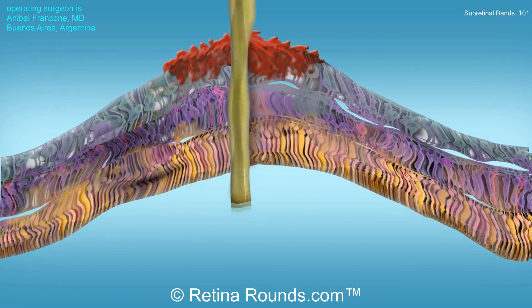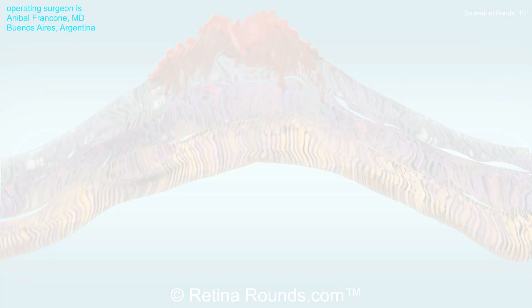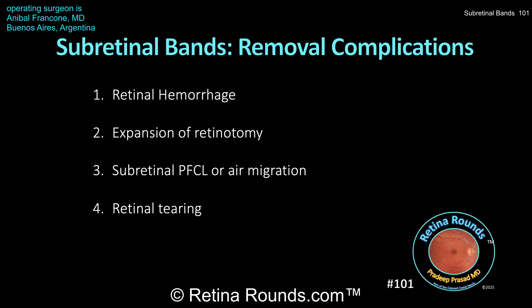In the process of removing that band, sometimes complications can occur. In this animation, we're showing that there can be hemorrhage at the retinotomy site. There are also a number of other complications, including expansion of the retinotomy. If PFCL or air is in the eye, those substances can migrate into the subretinal space. And if the band is long and tightly adherent to the retina in distal locations, pulling on that membrane can result in distal retinal tears.